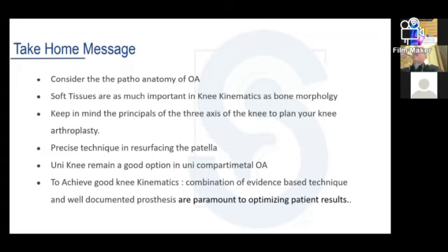When you have the femoral condyle here, for example, and you put your prosthesis laterally, you can draw it with your cautery.